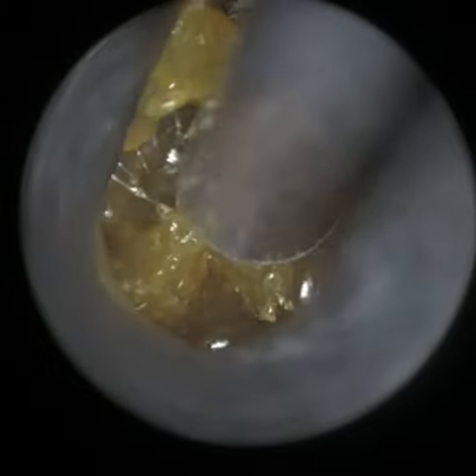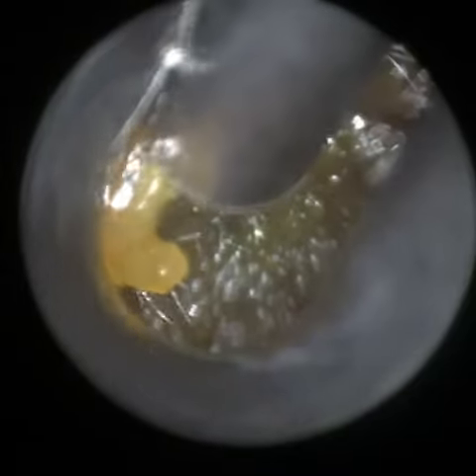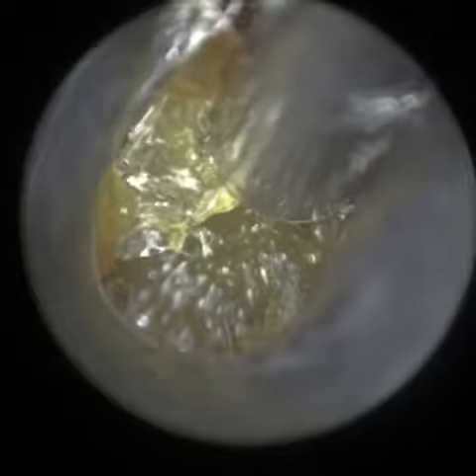Then we've got a larger one — a 5mm — for slightly larger ear canals, and also a 5.75mm for abnormally large ear canals, such as mastoid cavities for example. This wax is a bit denser, and I've just applied some olive oil spray myself, just to loosen it a little.